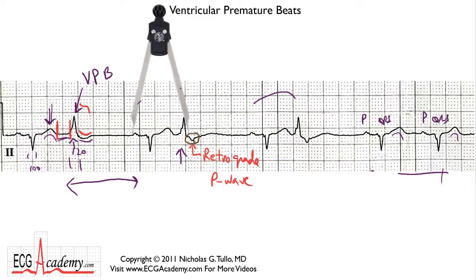The retrograde P wave landed right around the same point where the normal sinus P wave would have occurred. Following that, there is a compensatory pause. Looking at another beat, you also see a retrograde P wave following this ventricular premature contraction. So this is something you'll see again and again: an early beat with no P wave in front of it, followed by a retrograde P wave in many cases — though not always.